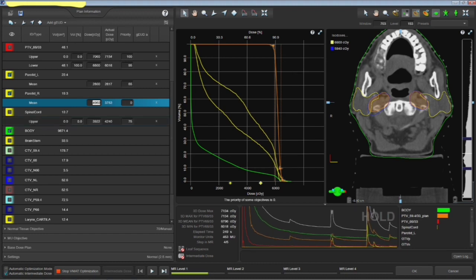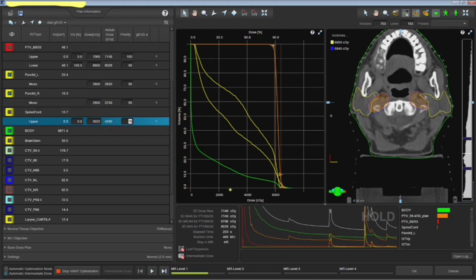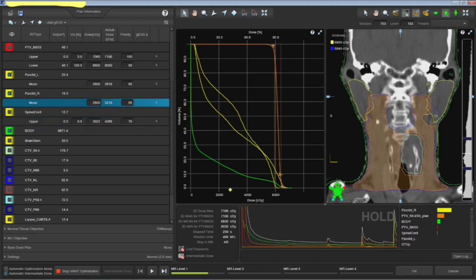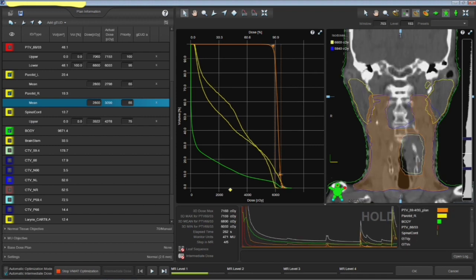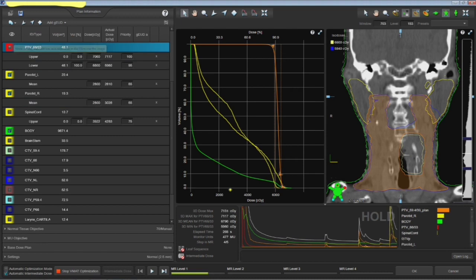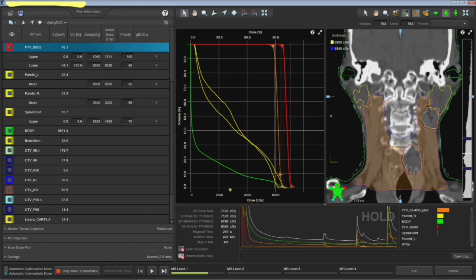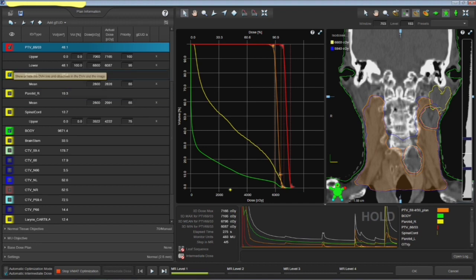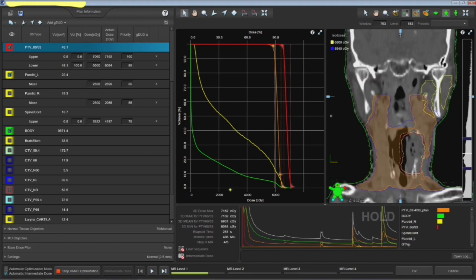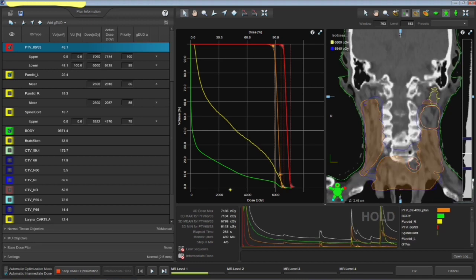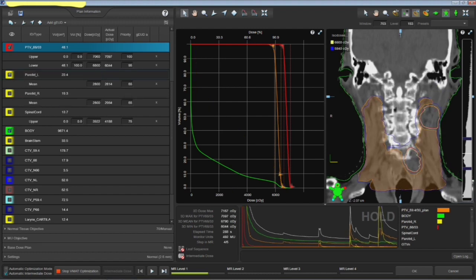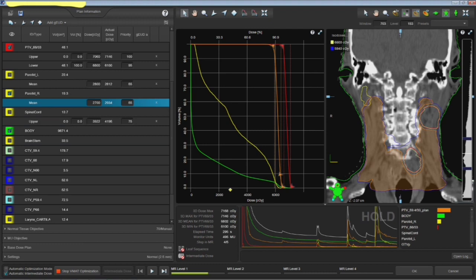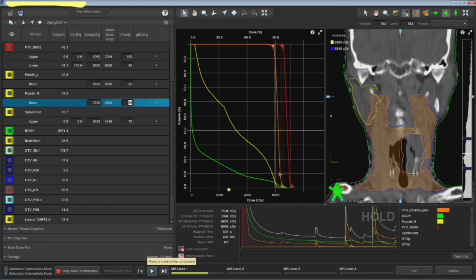So in this case concerned, it's not necessarily that both parotids should get the same dose because the GTV nodes are on the left side, so you should try to respect that and then not try to really reduce so much on the parotid on the other side. That's a GTV node actually.